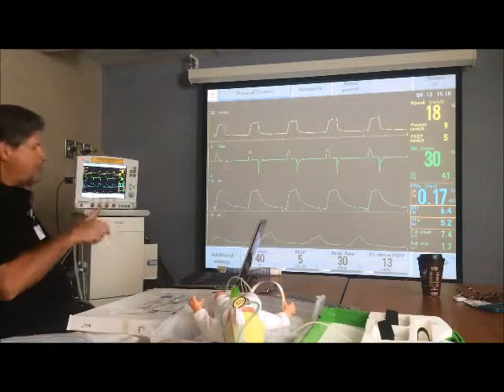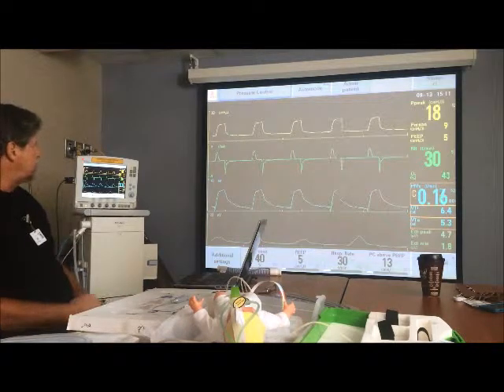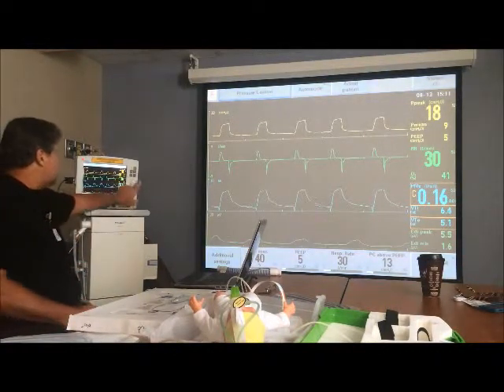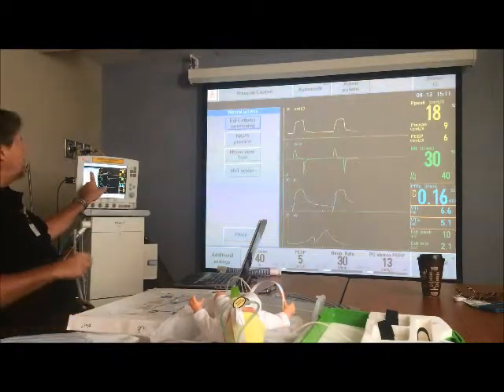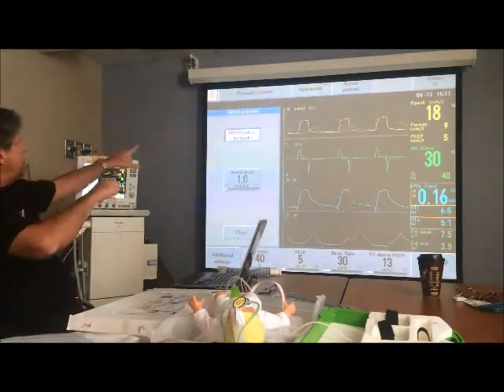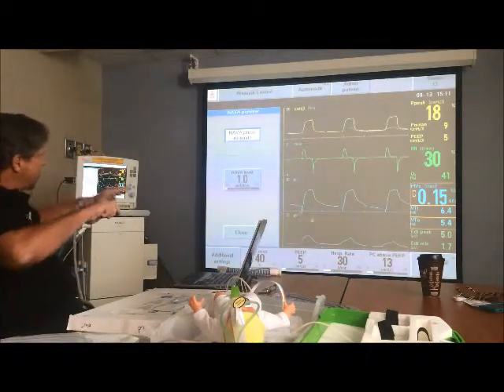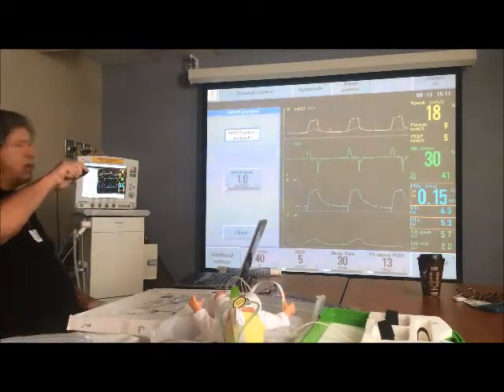But when you have a real patient here that's triggering the ventilator, it may look a little bit different, but this is somewhat typical. So here, see there, we didn't even deliver a breath. So we can go back to the neural access button, and we go to the NAVA preview button, this one here. So we touch it, and it will always come up with this button activated, in other words, white being activated. So it always defaults that way, because what I've basically done is taken the EDI waveform and superimposed it on top of the current pressure wave.